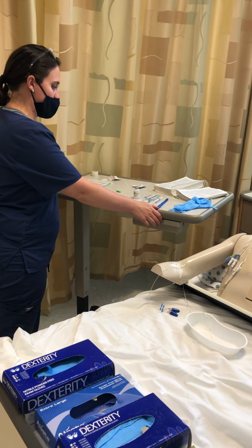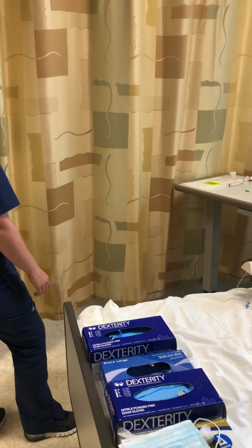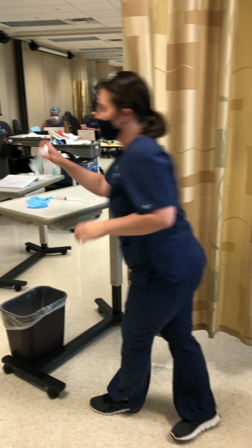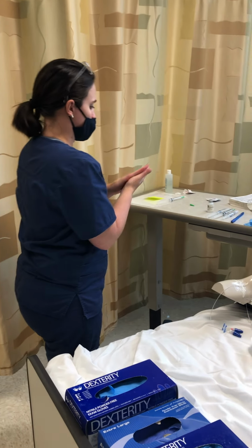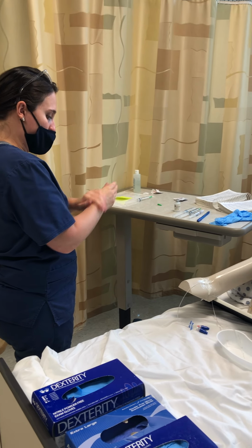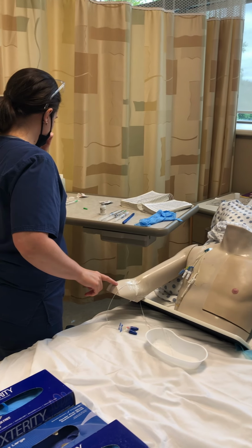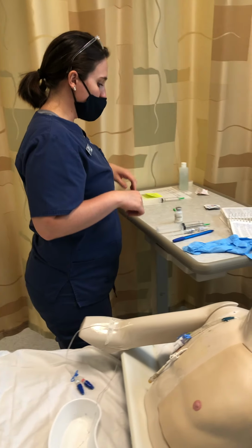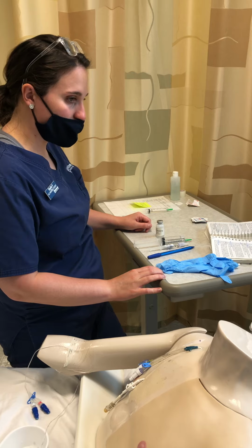Hi Bob, my name's Kaylee. I'm your student nurse. I'm here to administer your lorazepam. Can you verify your name and date of birth for me, please? He says Bob Owens, 9/22/33, and that matches what's on his wristband. All right, Bob, I'm going to be administering your lorazepam medication. Do you have any questions or concerns before I do that? And he tells me no.